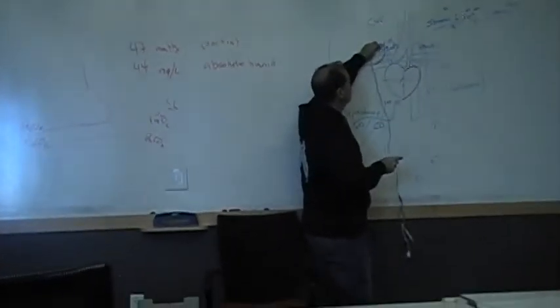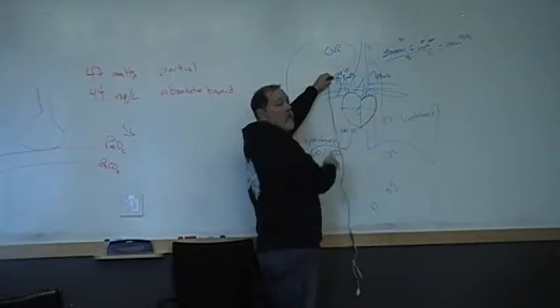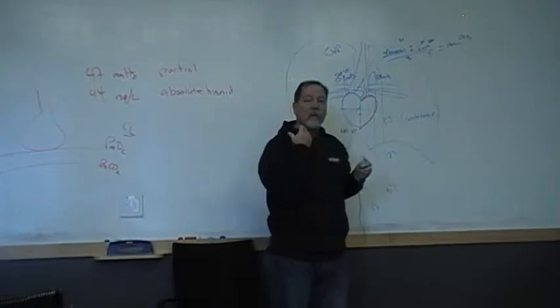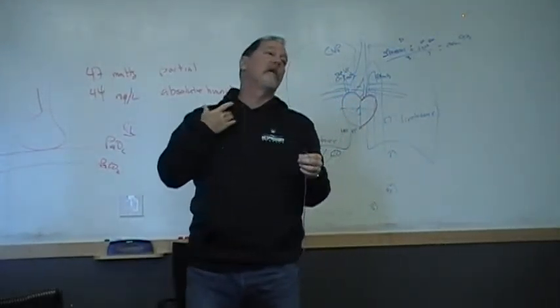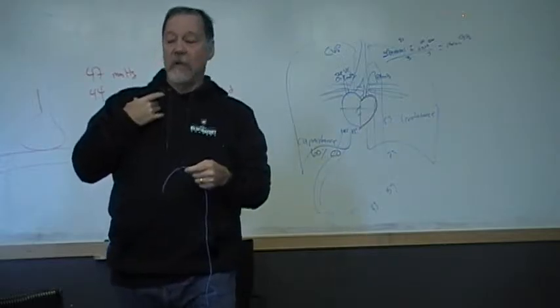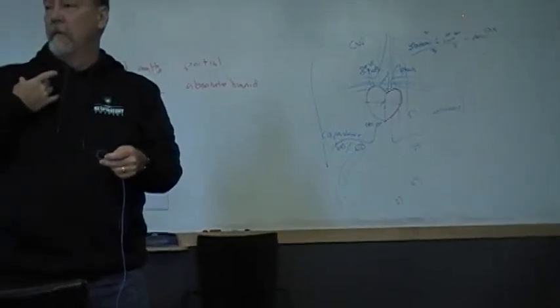Okay. That's crazy. So once this catheter gets into the right atrium, we'll stick it in through either the subclavian below the clavicle, or it'll come in through the internal jugular in the neck. What's a complication of inserting a catheter like this if we go in underneath the clavicle? What do you think could possibly happen? I guess it could pinch the line or something if they lay on it.